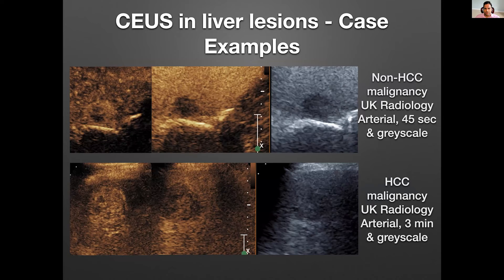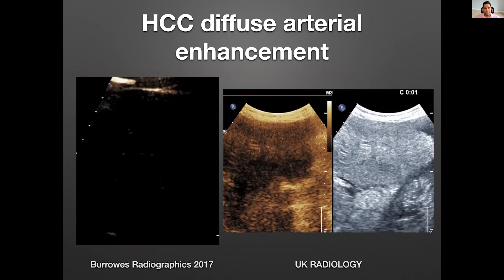Case examples from our university at UK: we see arterial phase enhancement with rim enhancement, and then at 45 seconds you already see washout — with a grayscale image to confirm lesion location. This favors a non-HCC malignancy. Down here, a pretty big lesion with heterogeneous but hyper enhancement on arterial phase, and at three minutes you can see that weak washout. This bottom panel points more towards an HCC malignancy.